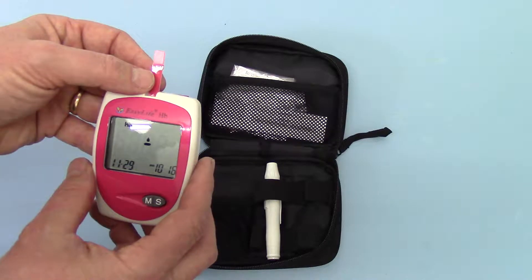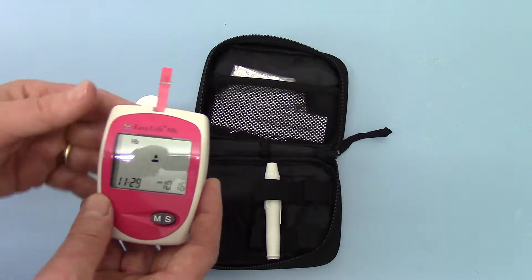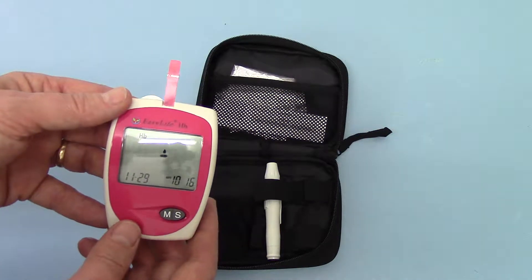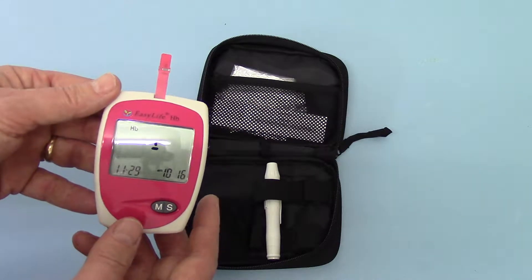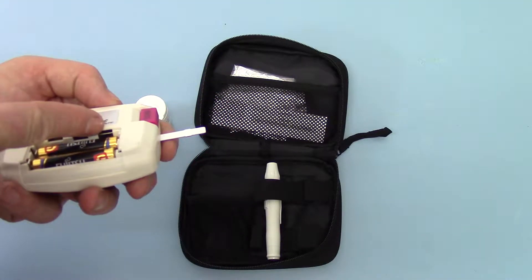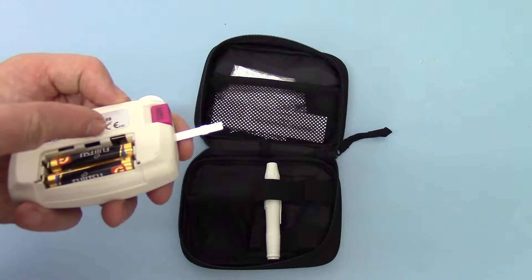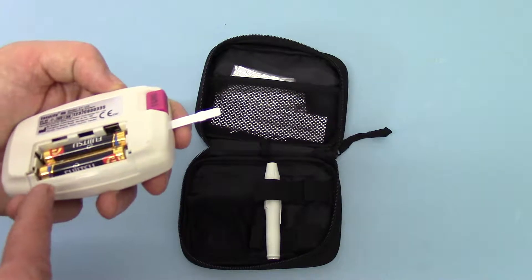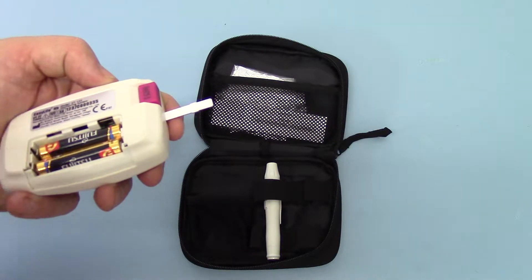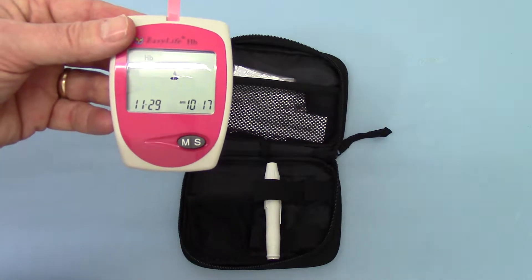There is one additional setup function that you need to check before you run your first test, and that is the display settings. These meters have the ability to display the haemoglobin reading in millimoles per litre or grams per decilitre. All UK references are made with regard to grams per decilitre. The setting for that is dependent on a tiny little switch inside the battery compartment — down in the base there is a little switch that goes this way or that way.